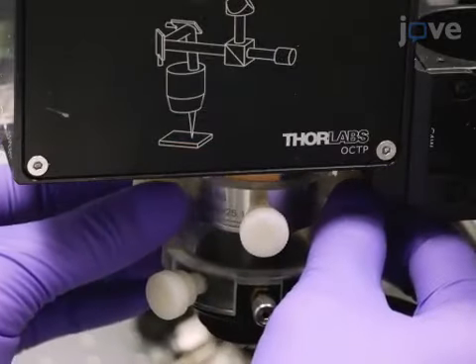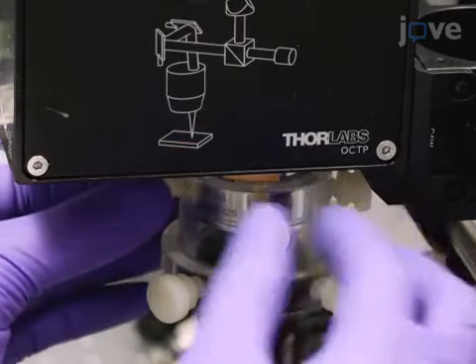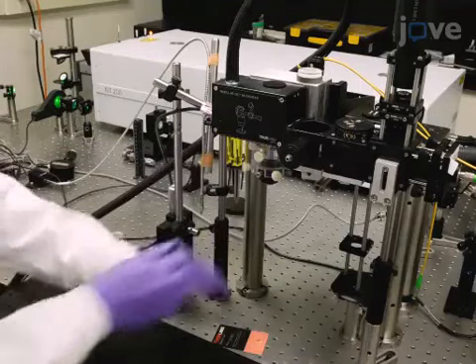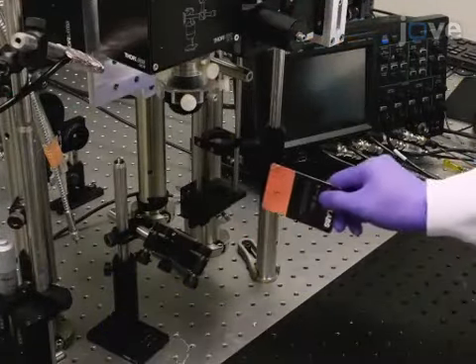Deliver the scanned beam through a telescope composed of a scan lens with a focal length of 36 mm and an ophthalmic lens with a focal length of 10 mm, and focus the beam on the fundus by the rabbit eye optics.